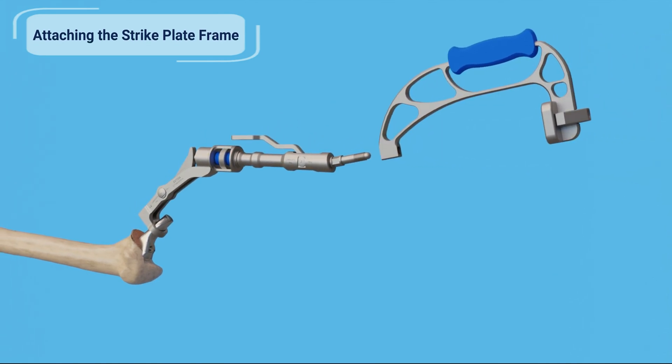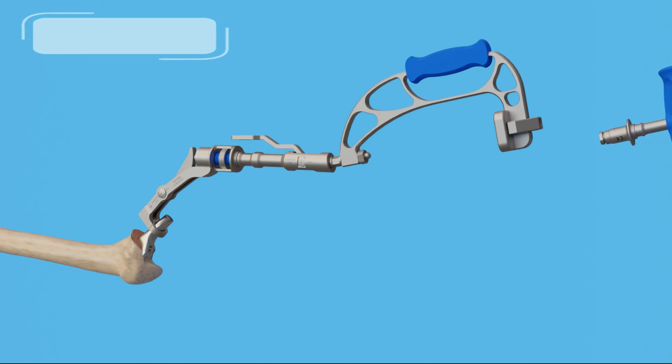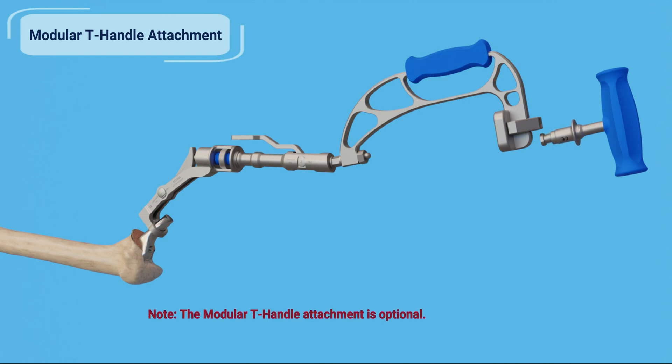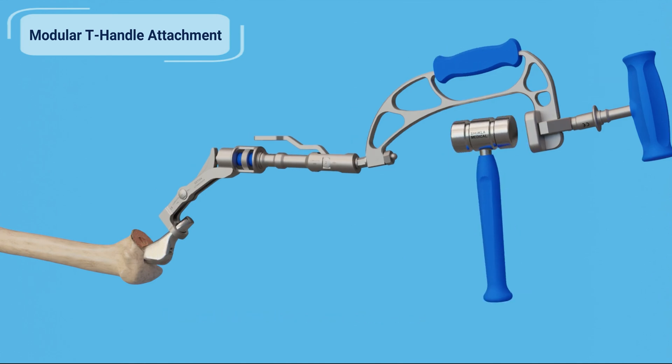With the extractor aligned and locked onto the hip stem, slide the strike plate frame and hex nut onto the proximal end. Tighten the nut with the wrenches. If additional grip is needed, attach the modular T-handle to the strike plate frame. Extract the hip stem with the strike plate frame and mallet.